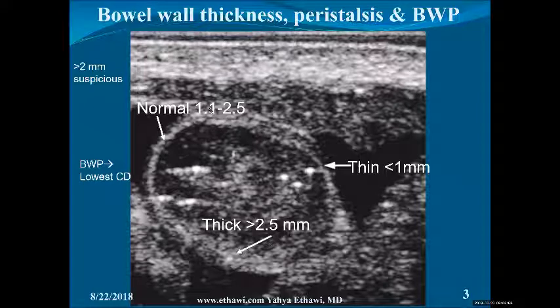So this is a highly magnified picture where you can see the bowel and you can see dots of air. You can see fluid and some other turbid materials. You can see the normal wall. Again, you can see dots of air inside the bowel.